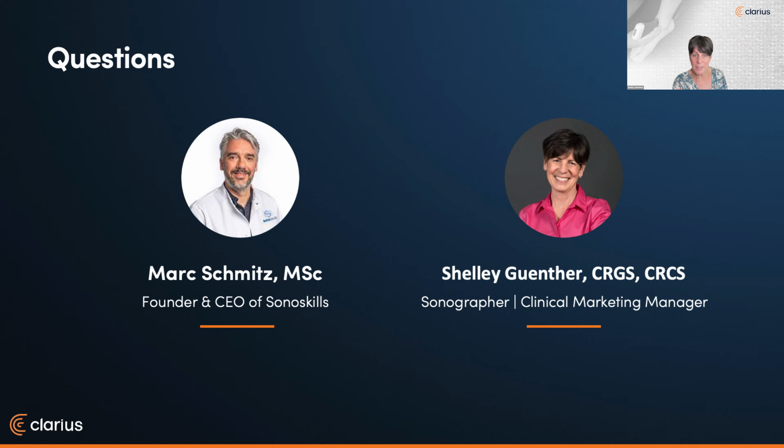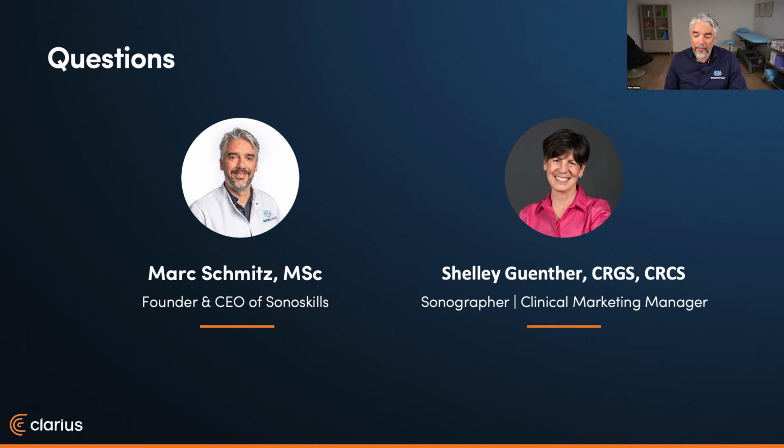Do you ever use ultrasound to assess plantar ulcers? I work in a radiology setting, and I have to say that I don't see that many plantar ulcers. But in the e-learning we offer, and also in the hands-on course, this course is taught by a podiatrist, and this topic is also covered there.